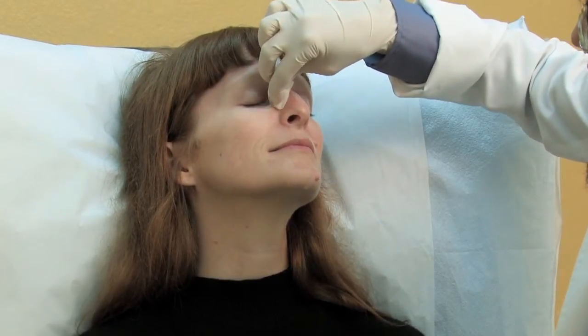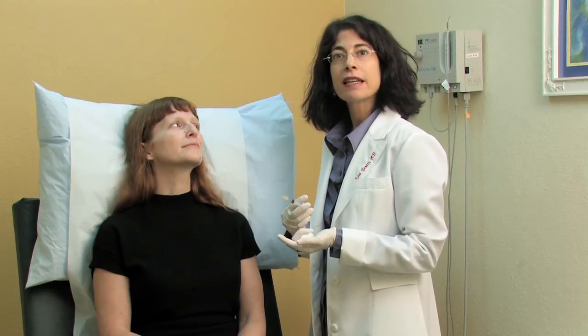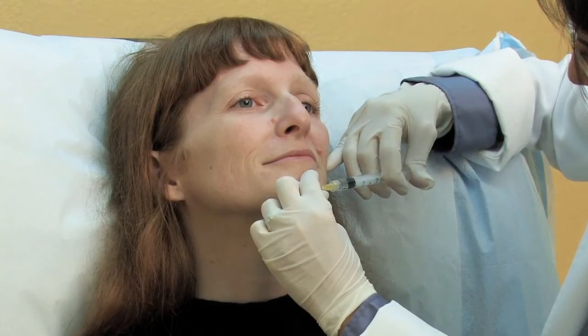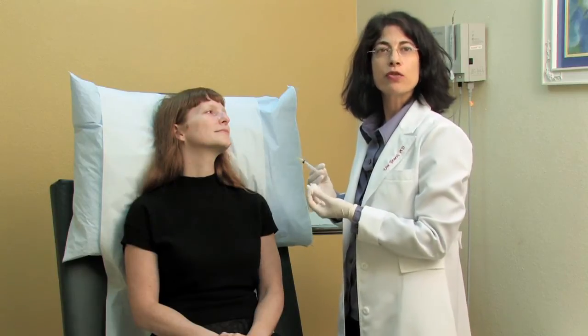Our next step will be to numb up the moles. We're going to use some local anesthetic for this. First I'm going to clean it with a little rubbing alcohol. Now we're going to actually numb the moles — we use a syringe with local anesthetic. It's actually pretty painless to do this procedure; you feel a little poke. The local anesthetic works quite quickly and we're ready to do our next step, which is removing the mole.